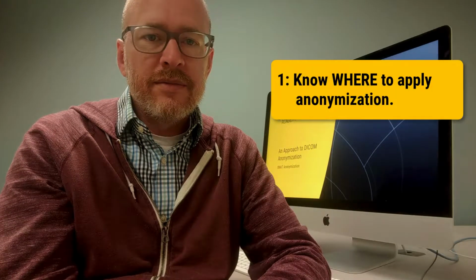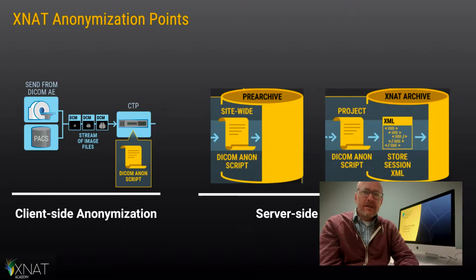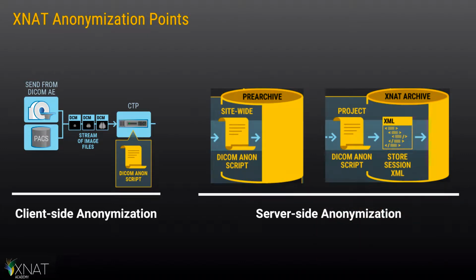With those caveats in mind, let's talk about how to develop an anonymization scheme that works for the projects that your XNAT supports. First, consider where to apply anonymization. As we've mentioned in the previous unit about image uploading, there are 2 points in time where DICOM anonymization can take place in a standard upload process: client-side or server-side. Client-side anonymization happens outside of XNAT before data is sent to the server, and server-side anonymization happens inside XNAT during the import process.